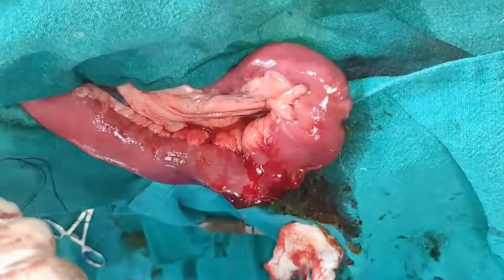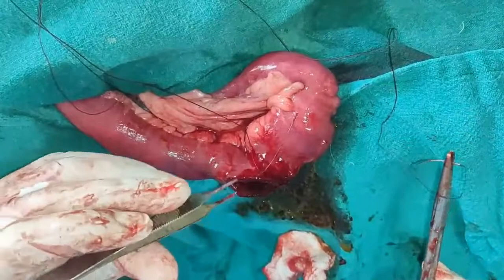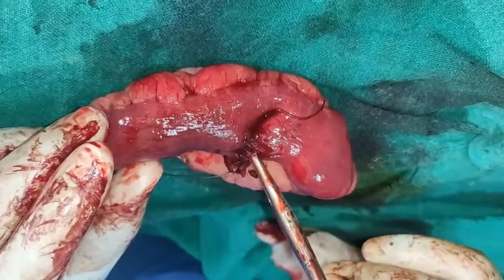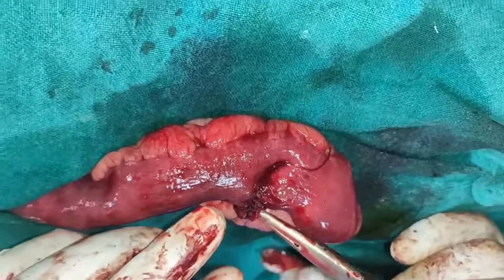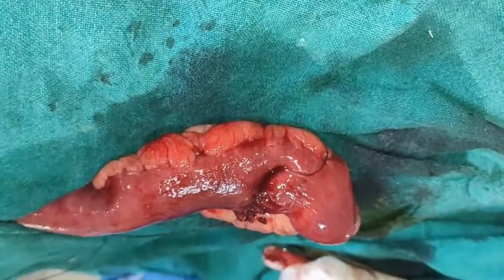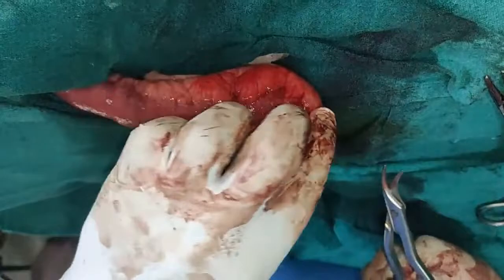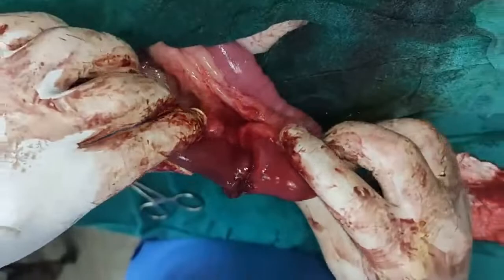okay. So this is the longitudinal incision repaired horizontally, so it will increase the lumen diameter. The starting incision was this one and this one, and we started from the midpoint of this side, from here and here. Now the longitudinal incision, the cranial and caudal commissures, are united here in the midway. Now we go for the second layer. I check thoroughly, and I think it would be better if I put one more suture here, because this area is definitely prone to leakage.